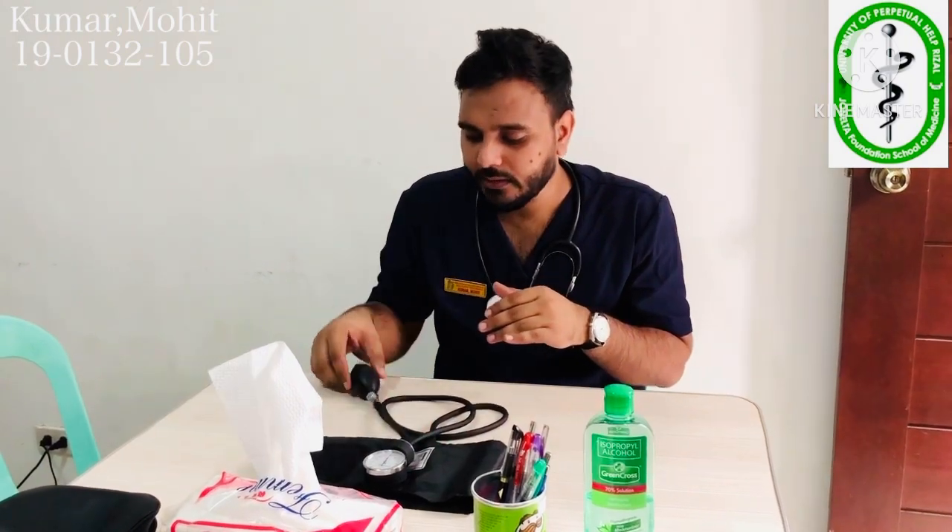Here we have the dial where we will get the reading, this is the pumping device, and this is the cuff. The important thing is the cuff should not be too tight or too loose, because if it is too tight it might give you a wrong or elevated reading of blood pressure.